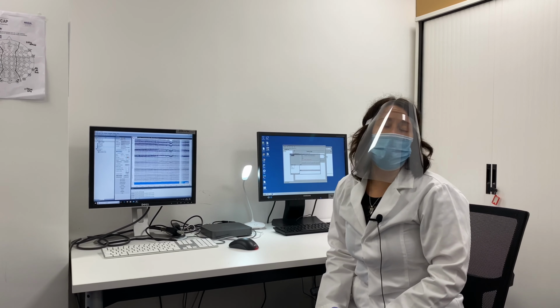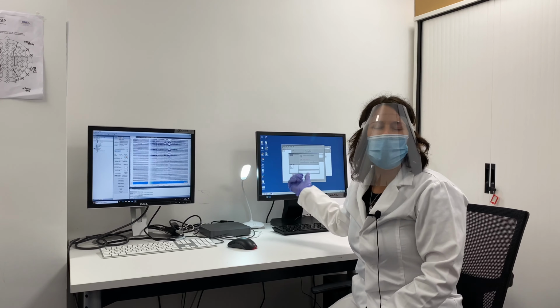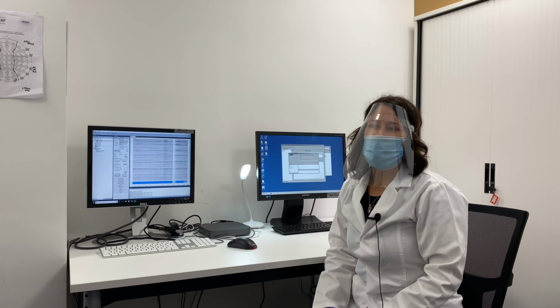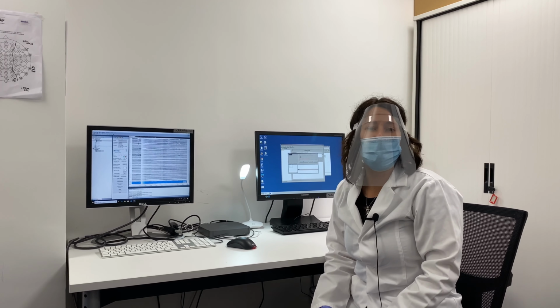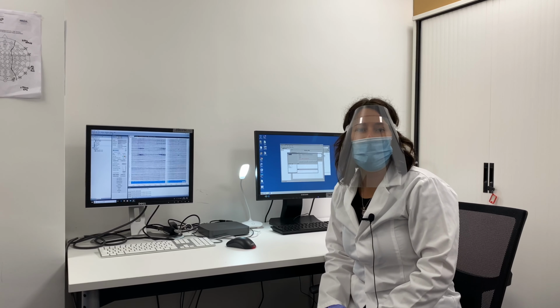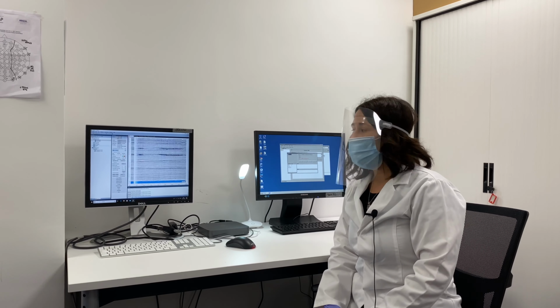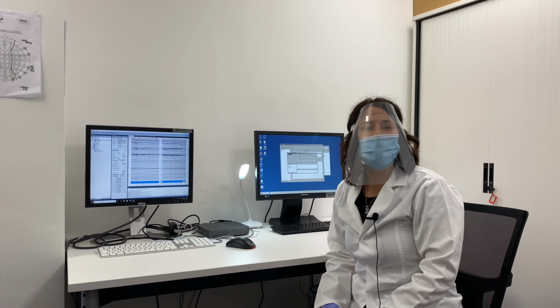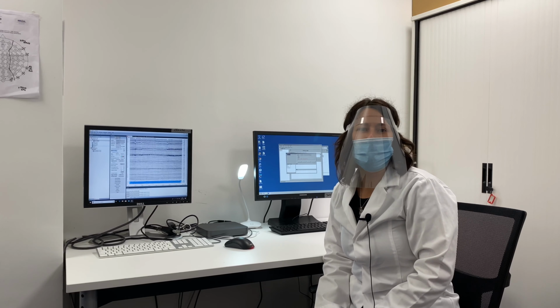Usually in an EEG experiment, we are recording brain activity but also behavior, because we are interested if we have a different kind of brain activity when we are performing a task, for instance, in an auditory task, or also in the visual learning experiment you could see prior to the resting state. In the end, we can then combine EEG, behavior, or even the questionnaires we are applying before the experiments.